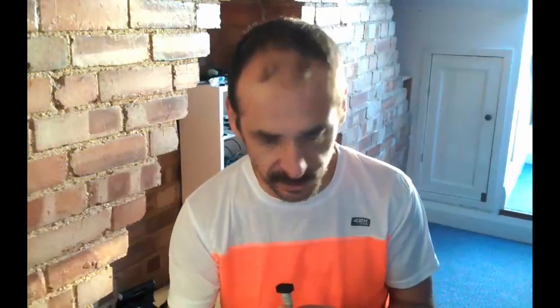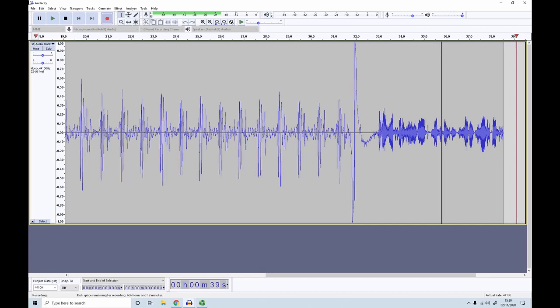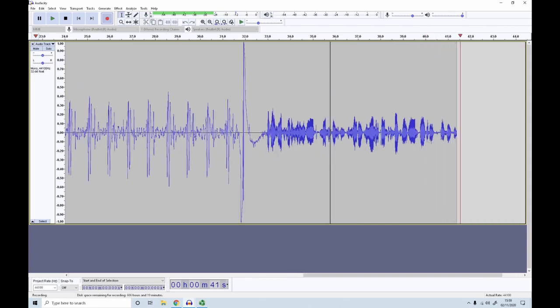Let me just start off Audacity to show that, and now I'm going to place it against my arm over that pulsating artery.